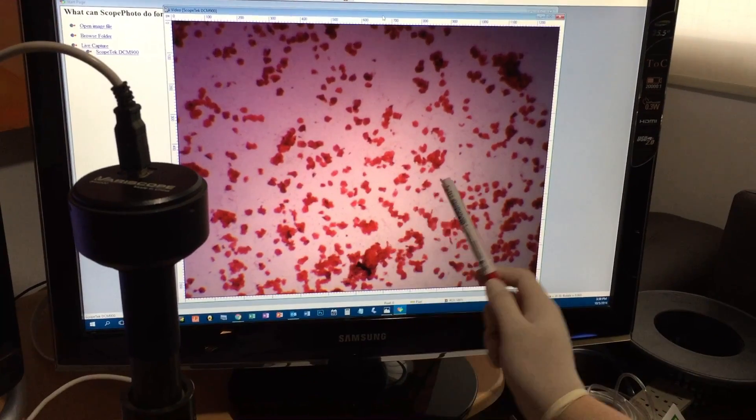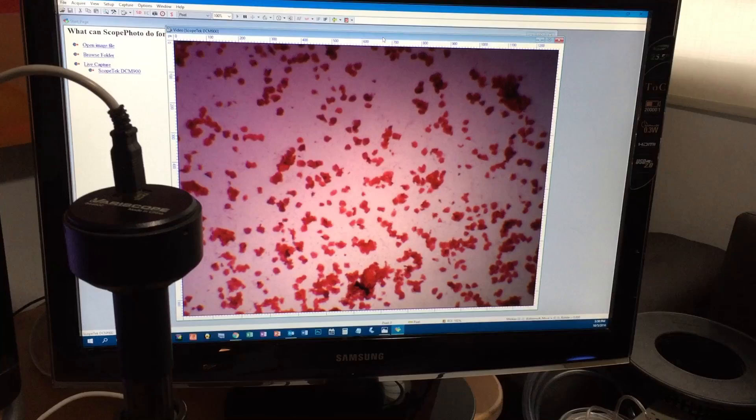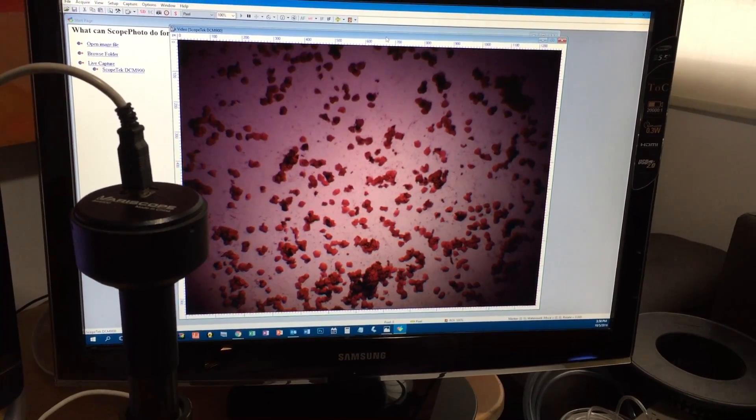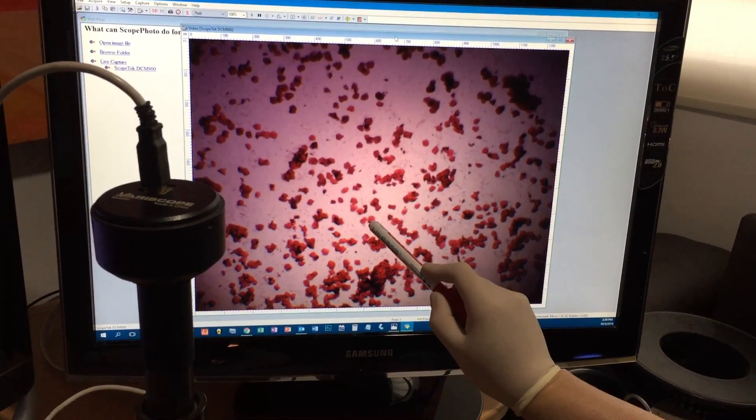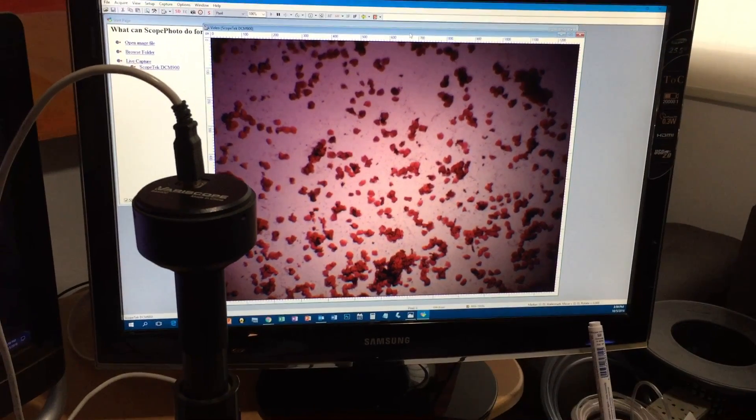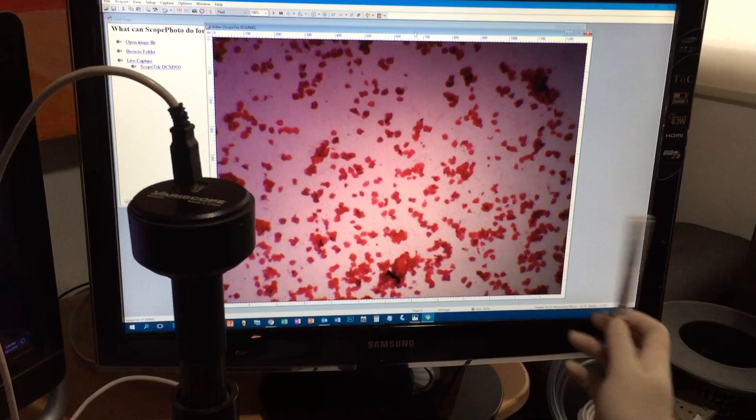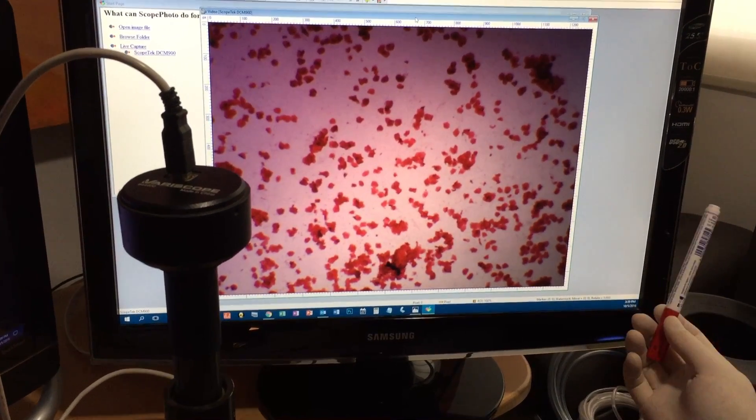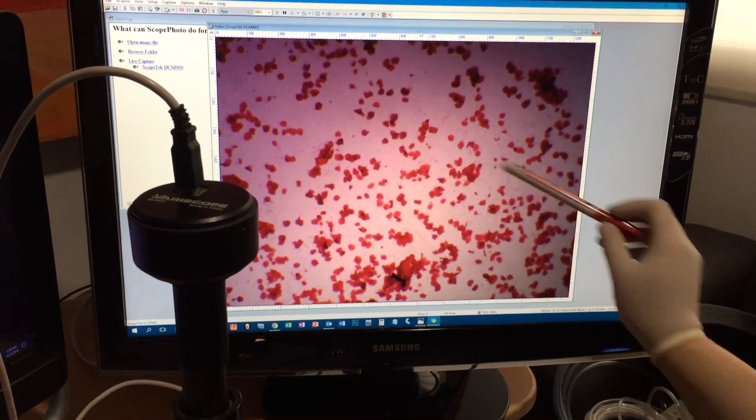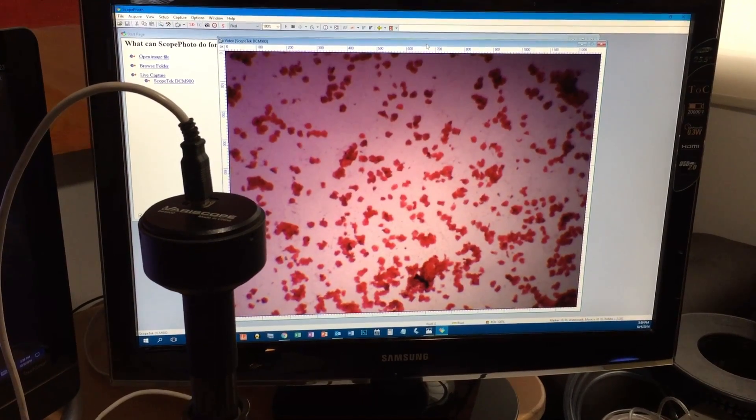They're anuclear. You can barely see any nucleus inside most of the cells. If you fade your microscope and you look at it like if you were looking at it backwards, you could see the little tiny nucleus inside the cells. So this is what you want to look for. So we're almost ready to breed, not exactly yet. According to the progesterone levels, you want to see that all this white is nice and clear.